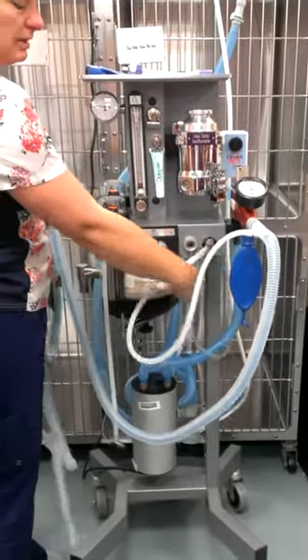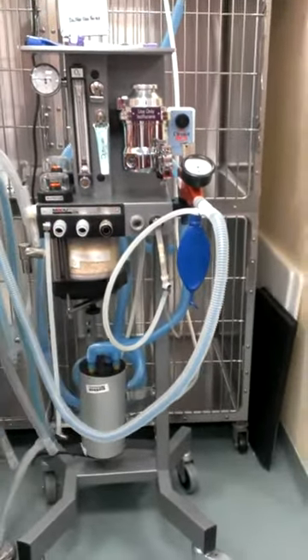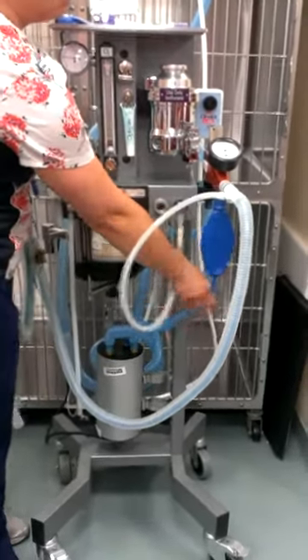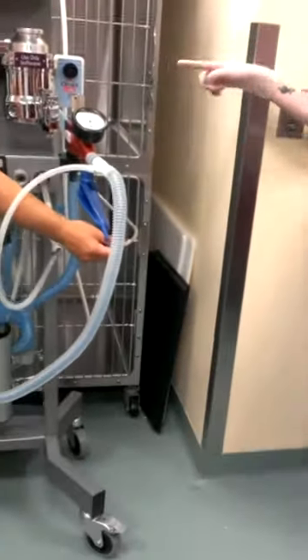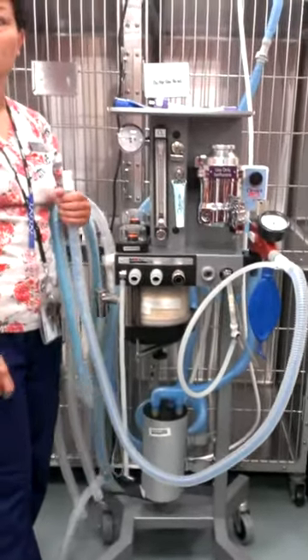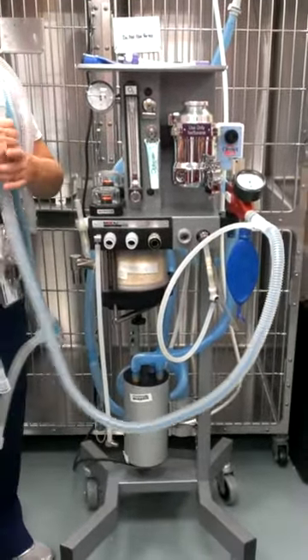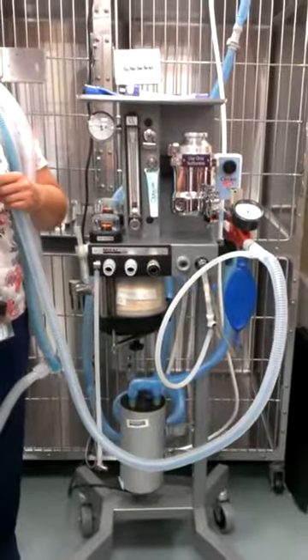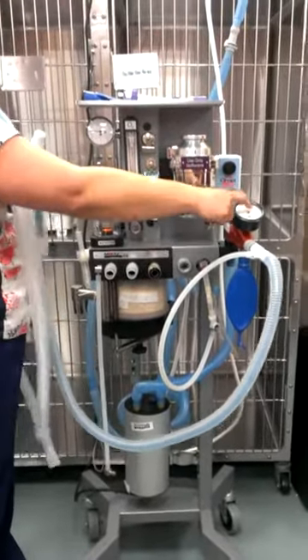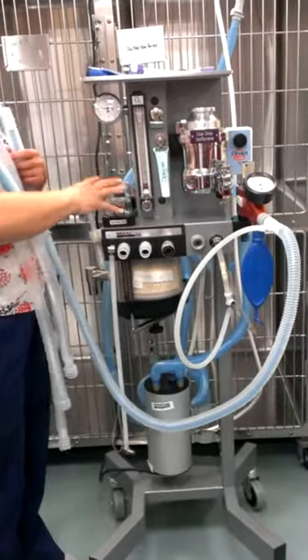This piece here — this line hooked into the oxygen line — goes to the alarm. That alarm tells us if there's too much pressure going to the patient. And how do we know how much pressure is going to the patient? The manometer. This manometer goes with this system, and that one goes with that system.